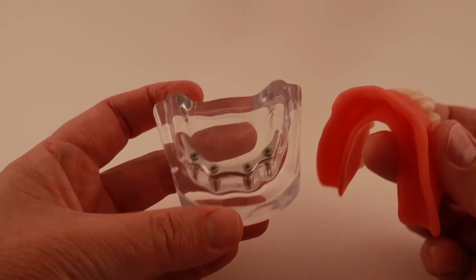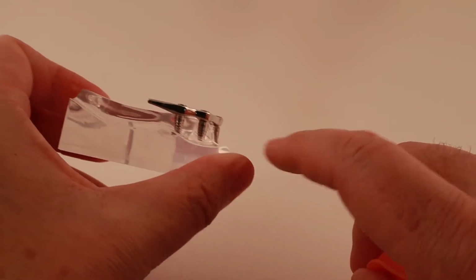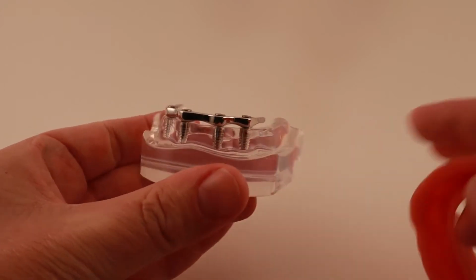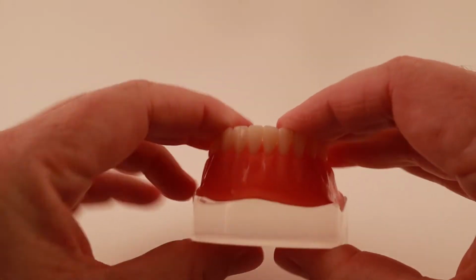The second type of overdenture is called an implant supported overdenture. This type of overdenture is actually held up by the implants and not by your gums. It usually consists of a metal bar which is attached to implants, and then the overdenture snaps onto the metal bar. There are pros and cons to each type of overdenture.